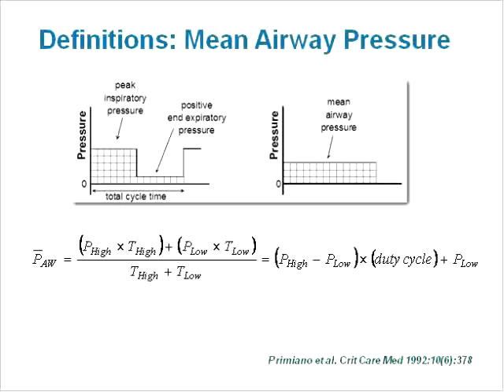In the graphic, we see that the area under the pressure curve for one ventilatory cycle is represented by 42 small boxes on the left at the top. In the graphic on the right at the top, we see the same area, that is 42 boxes, is flattened out so that the area occurs only under a constant pressure equal to the mean airway pressure. This is graphically equivalent to dividing the area by the total cycle time.